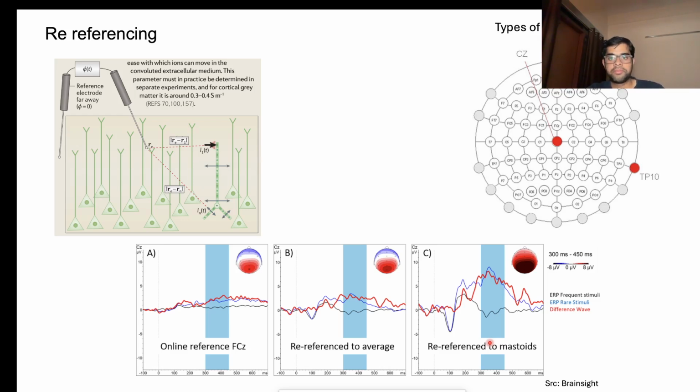But for many of the devices, there is a predefined reference, no? Or can we choose it ourselves? This is called re-referencing because it is done after collecting data. During collection there are electrodes called the common mode sense and driven right leg electrodes.